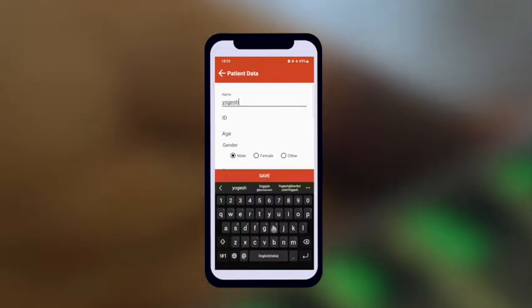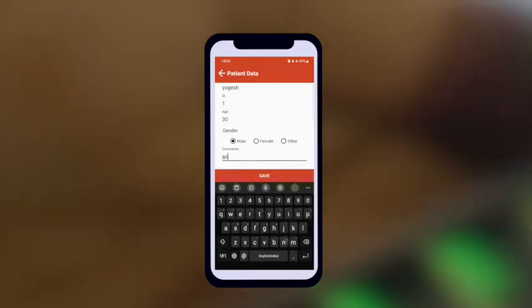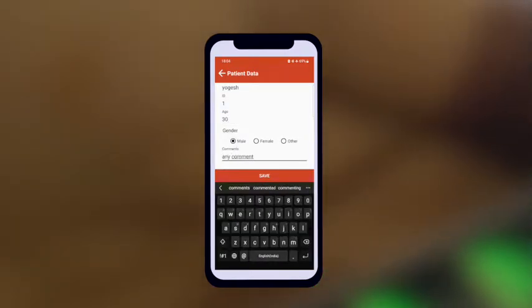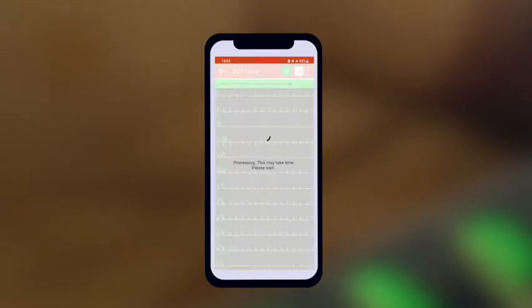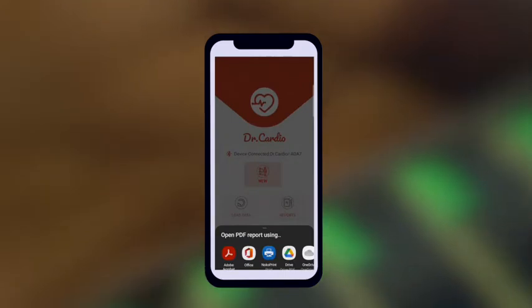Now you will be able to fill in the patient data like name, OPD number, and age. Add any comments if you want to and save the data. You should then be able to view an accurate, medical-grade ECG recording in the form of a PDF.